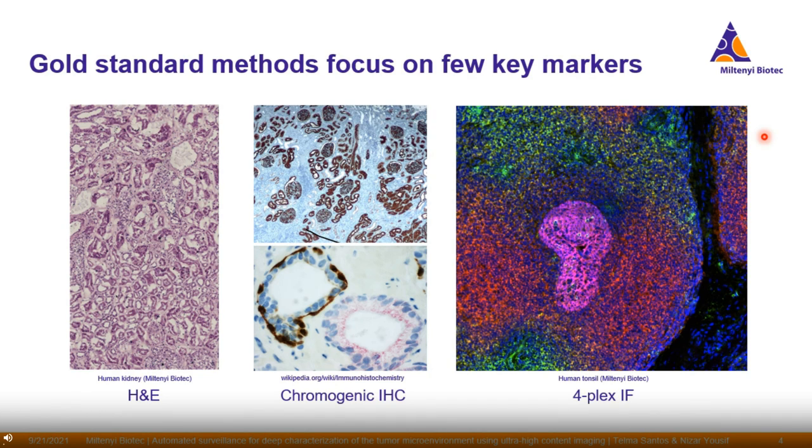But as you can see, because you would recognize that a composite normally has this kind of colors, we often do 3-plex, 4-plex, sometimes pushing it to show different markers. But this is quite limited. We always need some markers that are the standard ones. And if we want to go deeper into describing new ones or new combinations, this can get very complicated very fast. But why is it that we are limited?